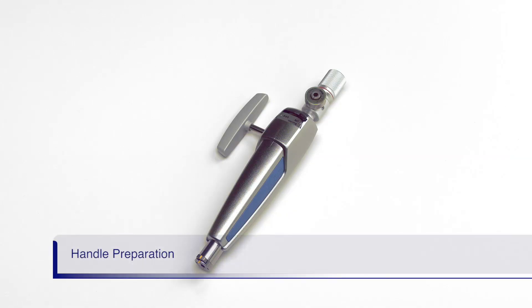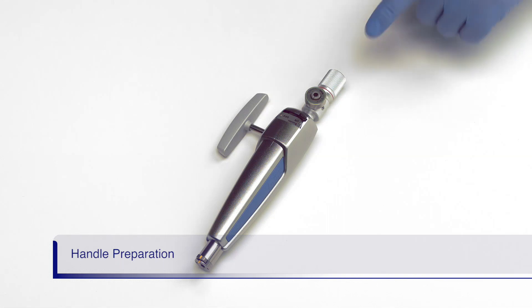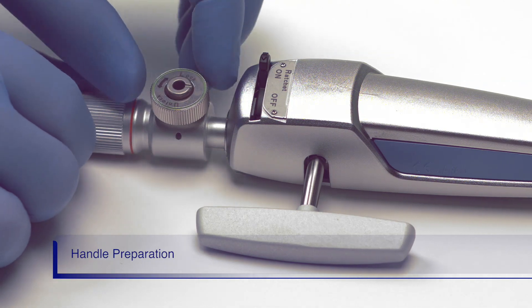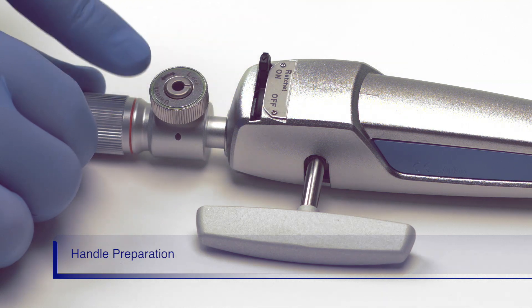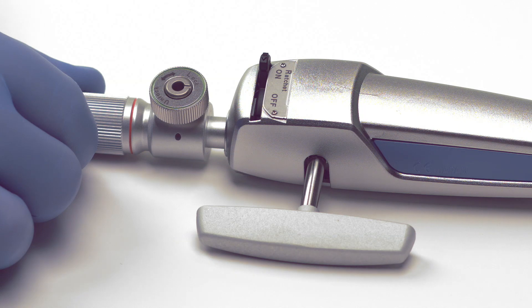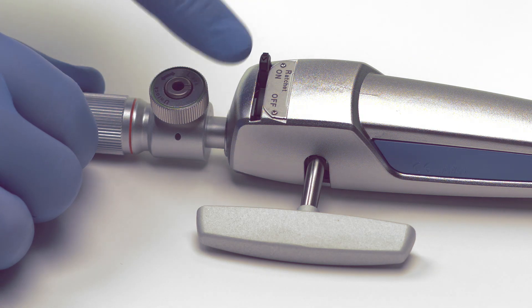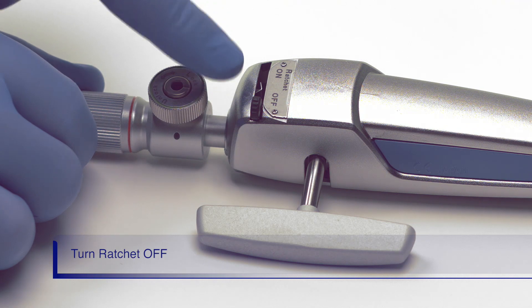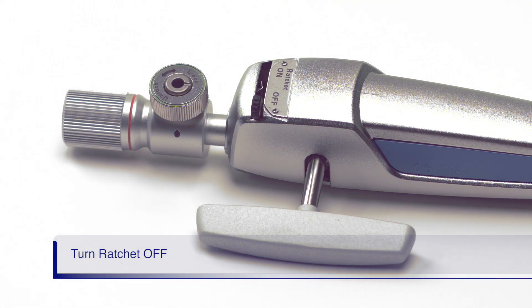Let's review the handle preparation. The unlock release button needs to be fully turned counter-clockwise as shown. If it is turned too far, the button will be in the locked position. Once the knob is fully unlocked, push the ratchet switch into the off position. The handle is now ready for assembly to the Lithicrush V basket.